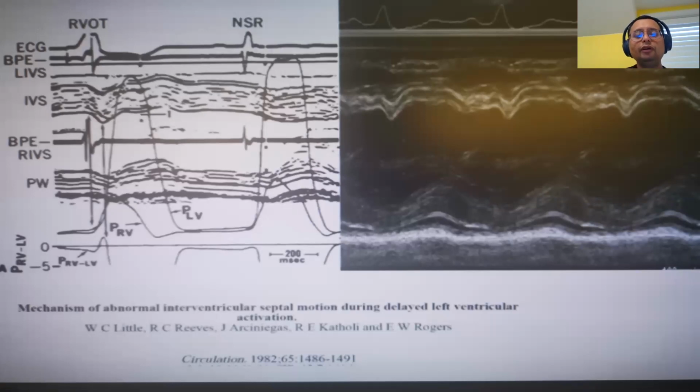However, this can also affect the heart muscle. If it only affects the ECG, we call it electrical desynchrony. But if it also affects the heart muscle, we call it electromechanical desynchrony. Those with electromechanical desynchrony, meaning there is desynchrony in the ECG and desynchrony in the ventricle, might respond better to resynchronization therapy. I might be wrong, Kokowe can tell. But what do I mean by mechanical dissociation?